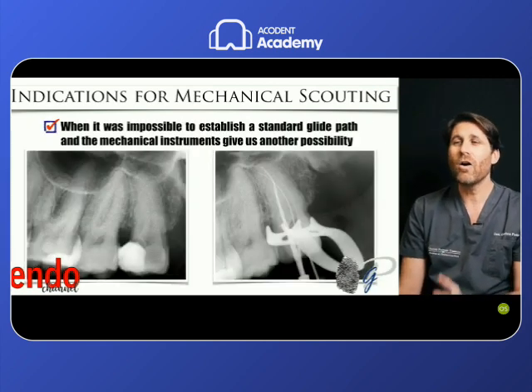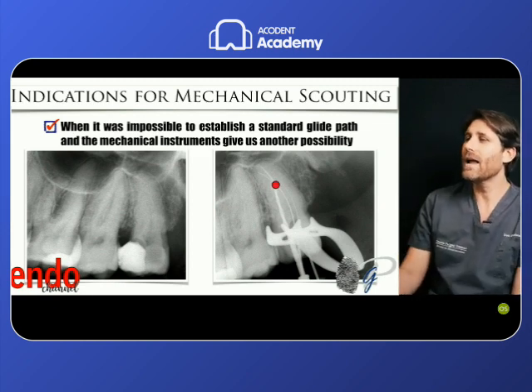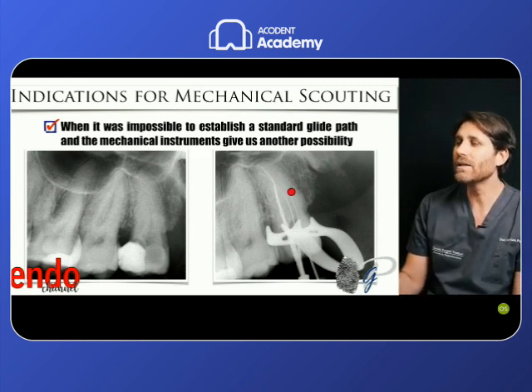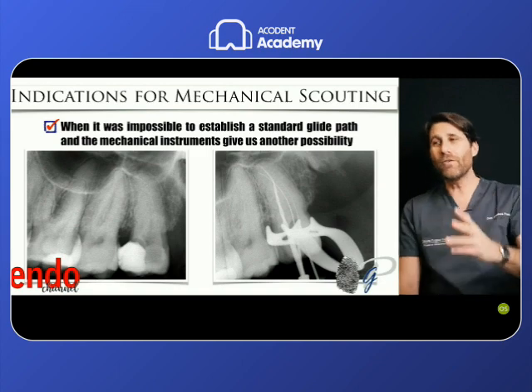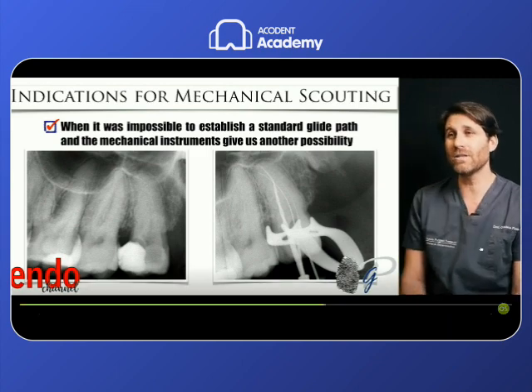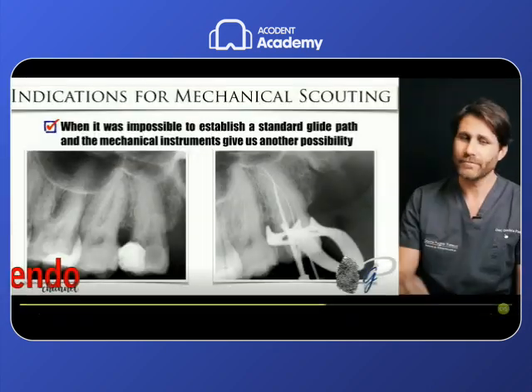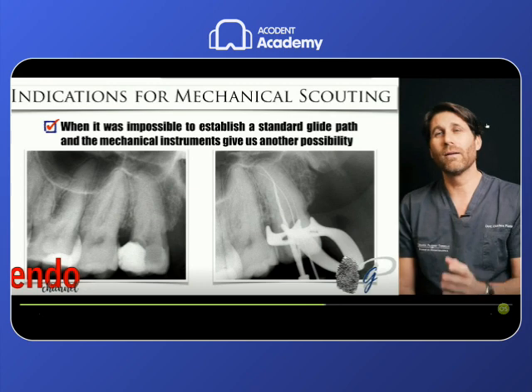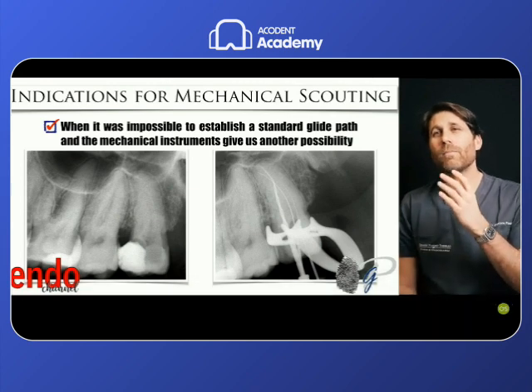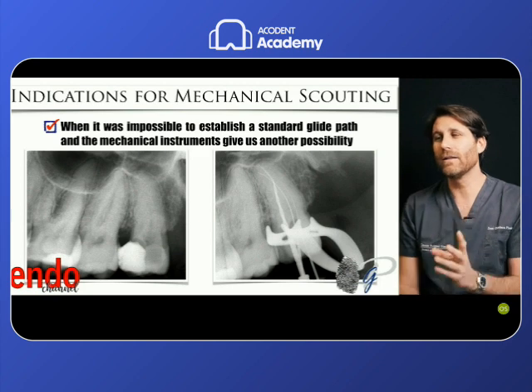And also, the other indication, obviously, is when stainless steel scouting is impossible in some cases and we stop, never push on them because they are rigid and you can create ledges, zips, you can move dentin debris apically and block the canal, so dentin blockages.